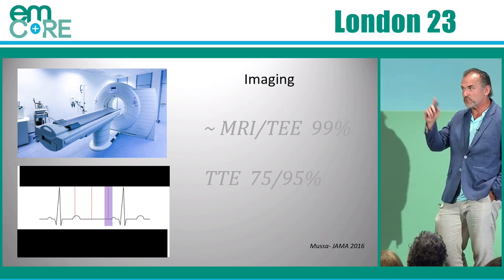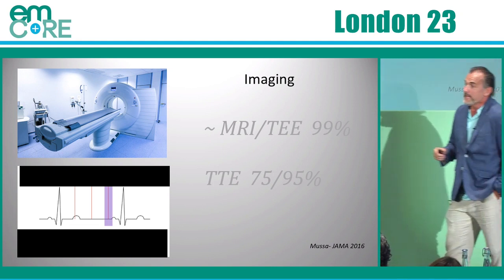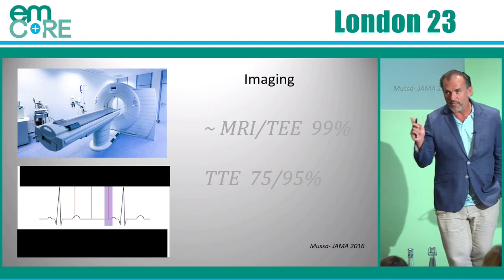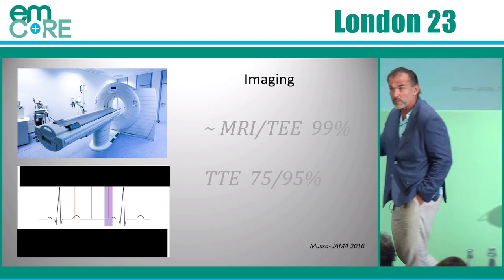So we have a special protocol for the whole aorta, number one. Number two, who does ECG-gated CT angios? And I'll tell you why that might be important. Has anybody heard of it or do it? Did they protocolize that?